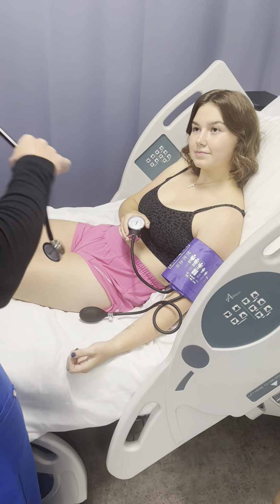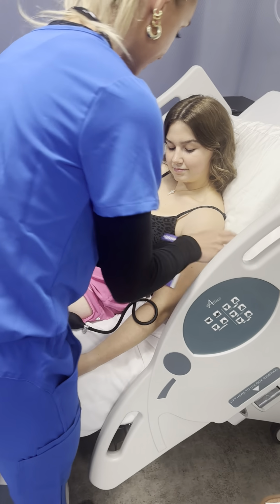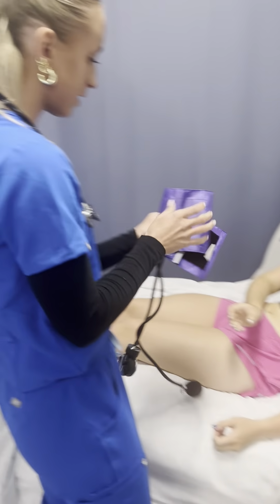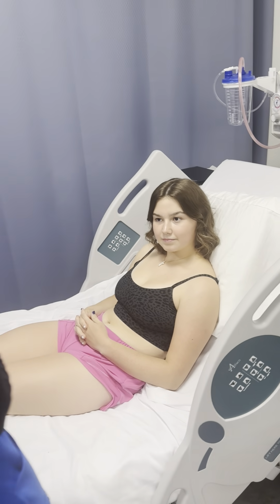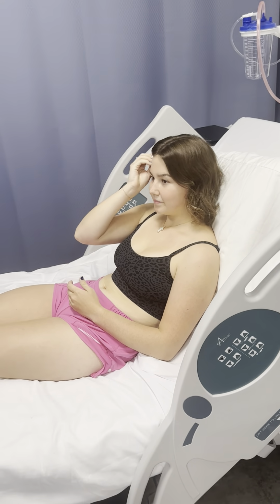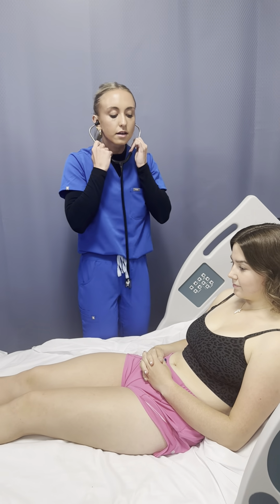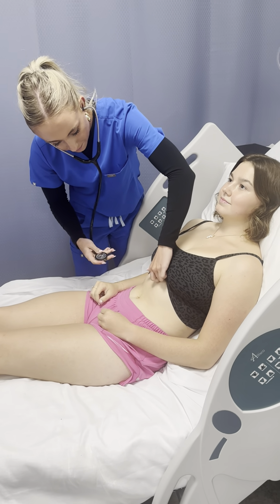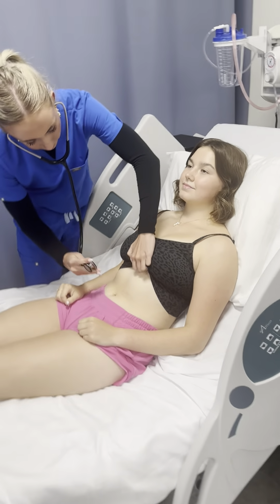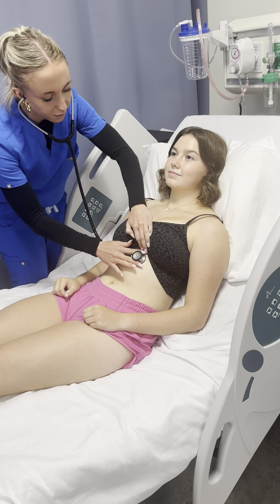Perfect. And for blood pressure, I got 108/74. So that looks good. And then now I'm just going to listen to your respiratory. Okay. Actually, first I'm going to do your apical pulse. Okay. I'm going to listen with my diaphragm for 1 minute, okay?